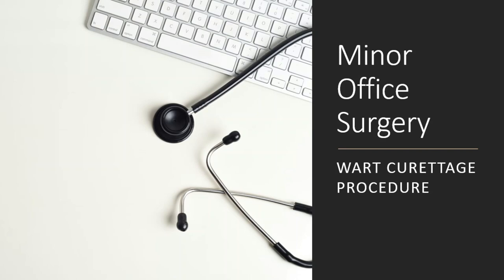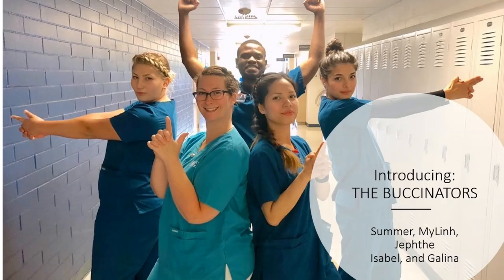Today we will be performing curettage on a wart, a minor office surgery, starring the Buccinators.